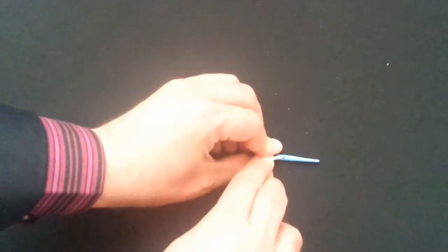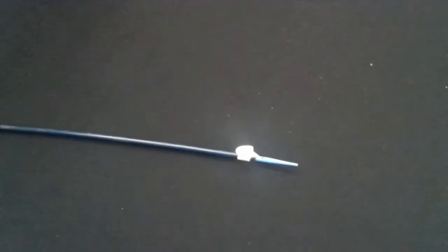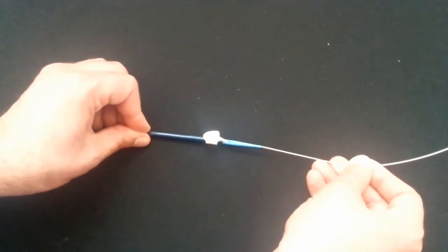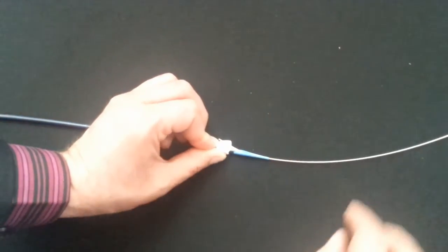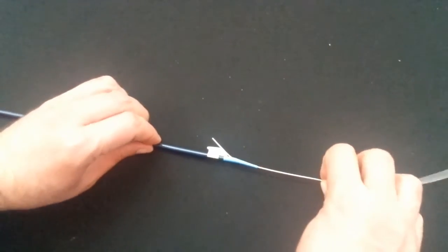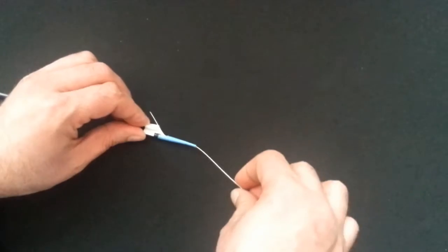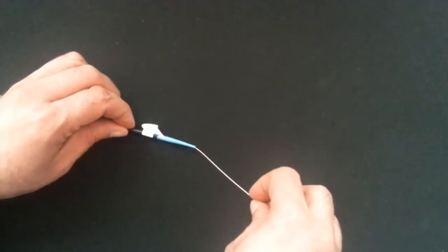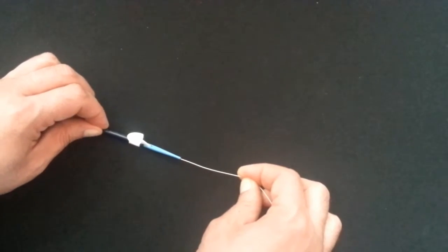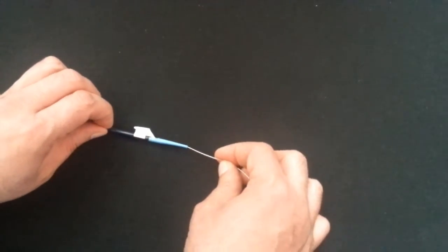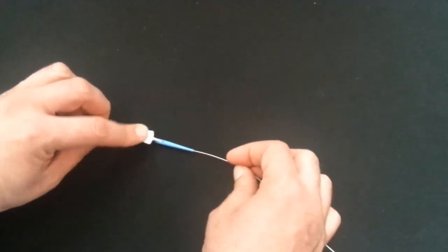Either for the stiff end of the guide wire, but also for the floppy tip of the guide wire. Sometimes there is difficulty to backload the guide even with the backloading clip.